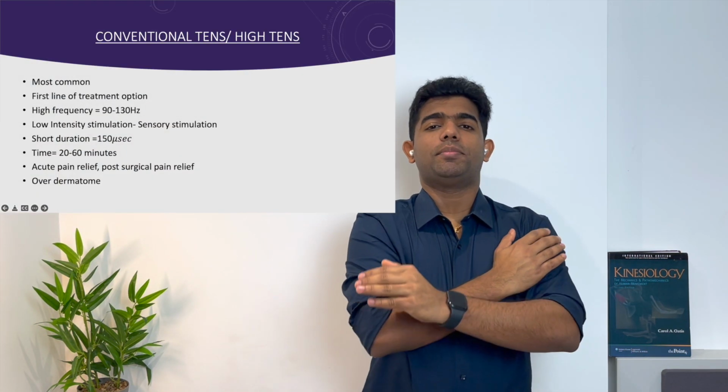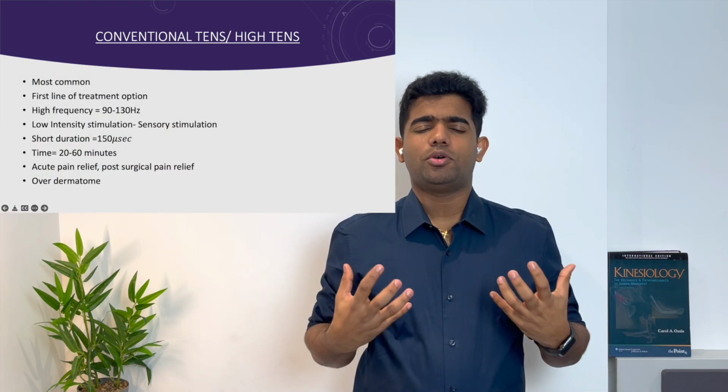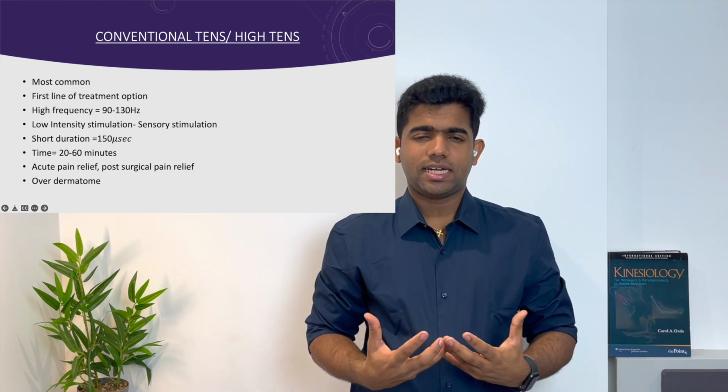It has a short pulse duration, nearly 150 microseconds. The treatment time is usually 20 to 60 minutes, and it is primarily used for pain relief, acute pain or post-operative pain relief. And conventional TENS is mostly applied to the dermatome.